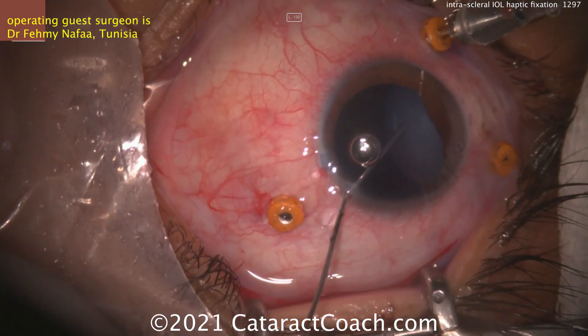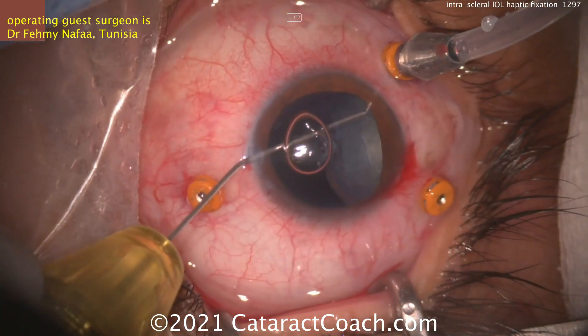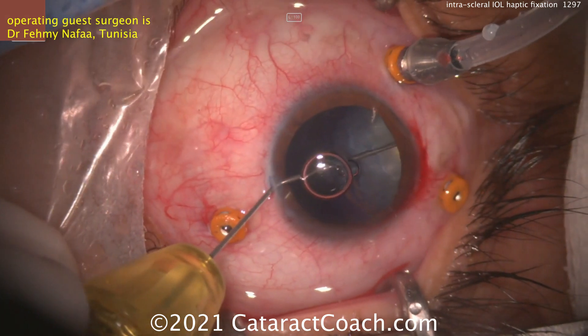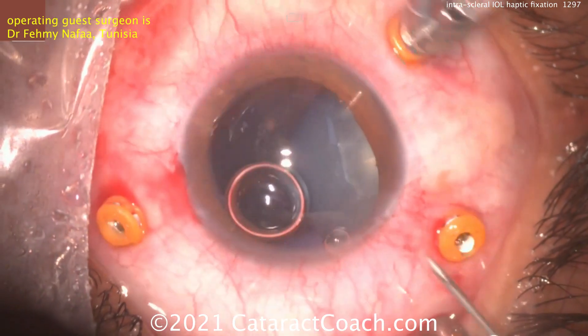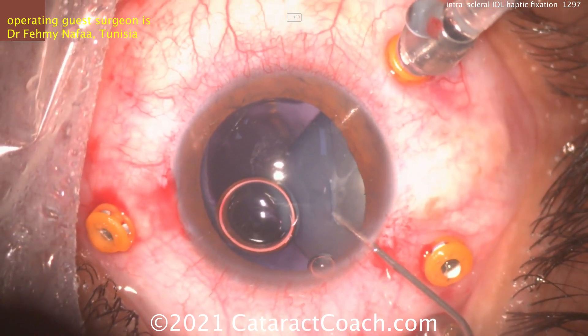TriPan Blue dye going in. Be careful — don't want to stain the vitreous too much. It's going to be tough to stain just the lens. Now viscoelastic going inside, and perhaps going to attempt a capsulorhexis, or at least start it so you can hook the capsule. There's the instrument being used to start some sort of capsule opening.